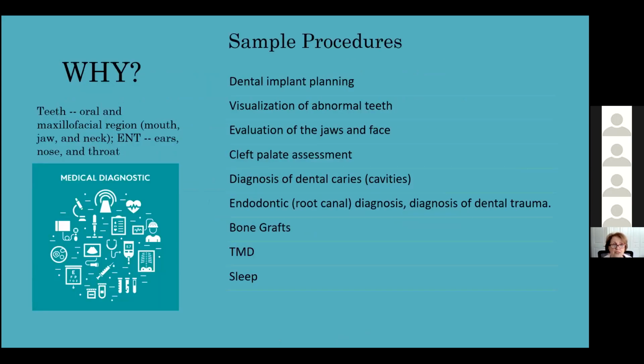What can you do with a CBCT scan in your treatment planning? Well, implant planning. If you're not billing implant planning, even for medical, you're not billing your stent. You're not billing a before scan to diagnose. You're actually able to bill for when you place, to make sure they're all in the right area. And you can bill for a final scan to make sure everything is healing and everything is fine. But you do need to have those read. The evaluation of the jaws and the face.